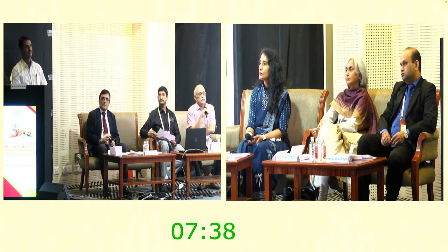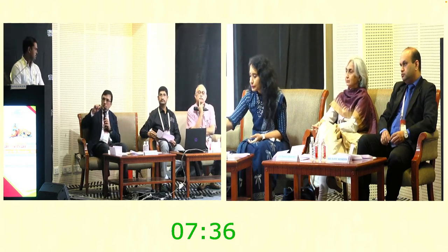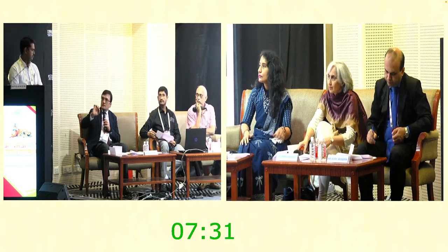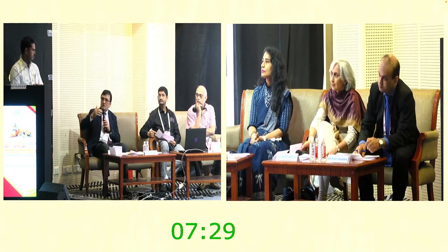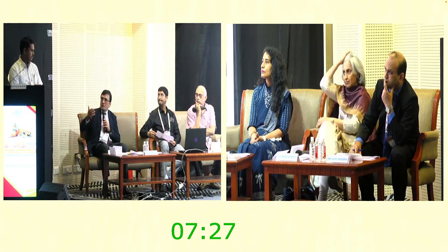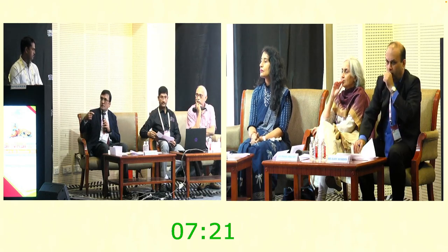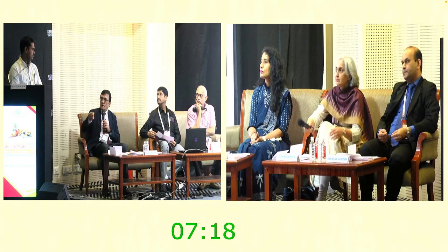Rajesh, you had a scleral tear going inside. Yes, sir. The gelatin sponge is natural. Yes, sir. What happens to the scleral edges once the gaping, you have to suture there? What do you do? Or do you go back and put in a graft?